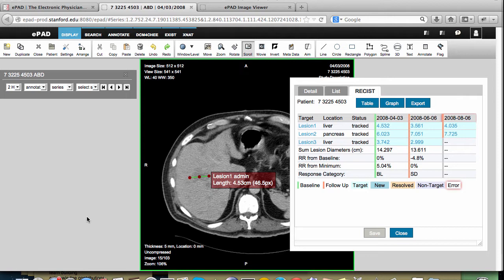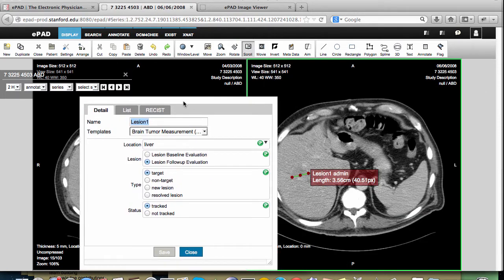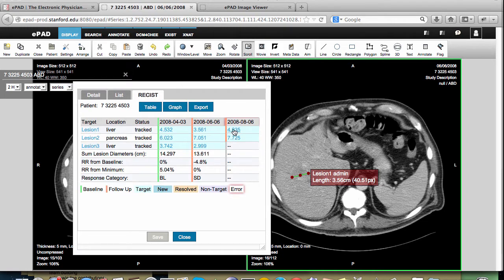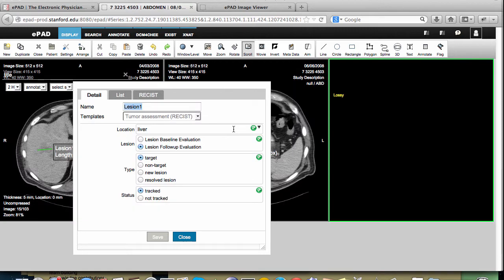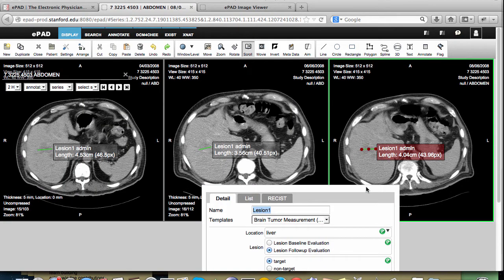We can quickly see from this tabular summary that this patient has three lesions that were reported previously on two different prior studies. We can look at the actual image and its annotation for any measurement done previously simply by clicking on the measurement. So here's lesion 1 in the 6-6 time point, and here's lesion 1 in the 8-6 time point. For lesion 1, I can see all three time points side by side.